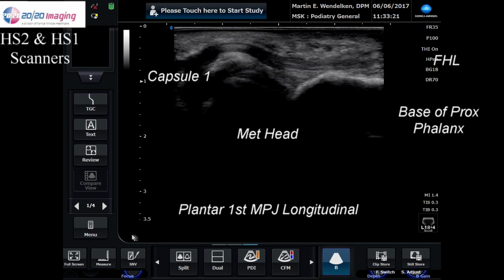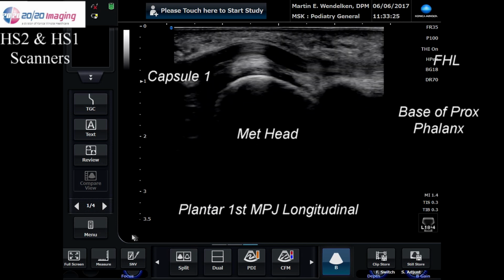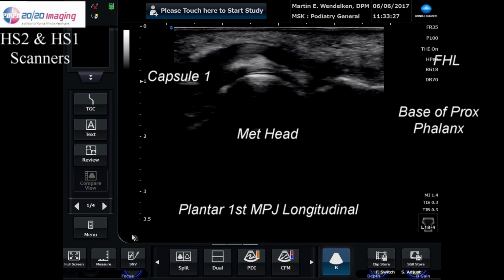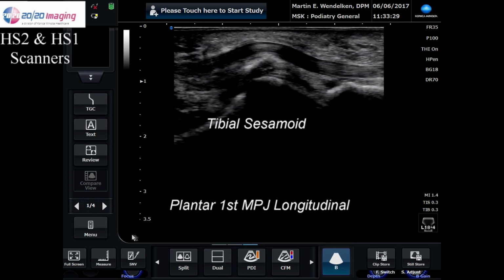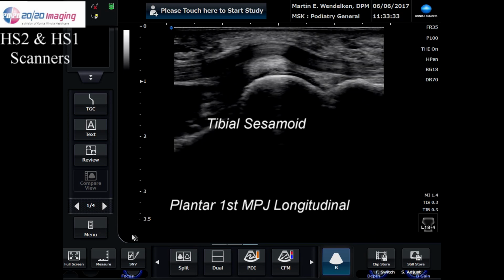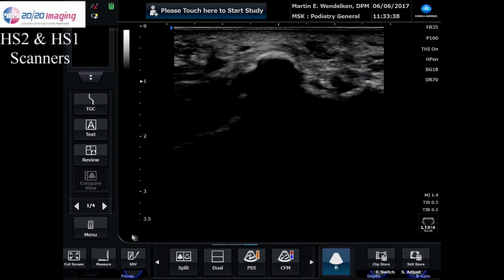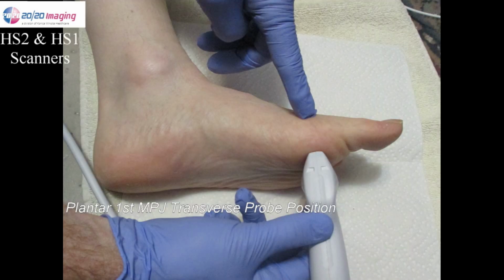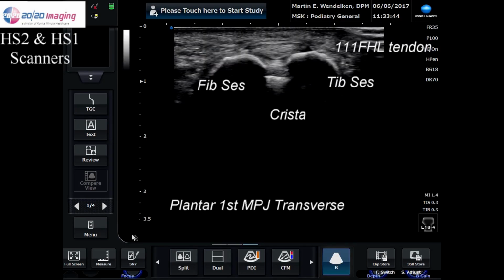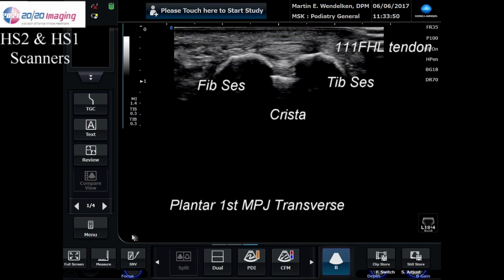Now moving the probe distal to the metatarsophalangeal joint, you can see the base of the proximal phalanx, the joint capsule, the plantar plate there. I'm going to move the probe medially to demonstrate the tibial sesamoid, go back laterally in between, and now lateral to the fibular sesamoid. Let's now turn the probe transversely, where now you'll see on the plantar aspect the flexor hallucis longus tendon transversely, the fibular sesamoid, tibial sesamoid, and the surface of the crista.